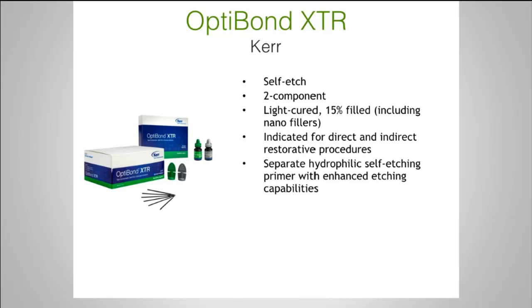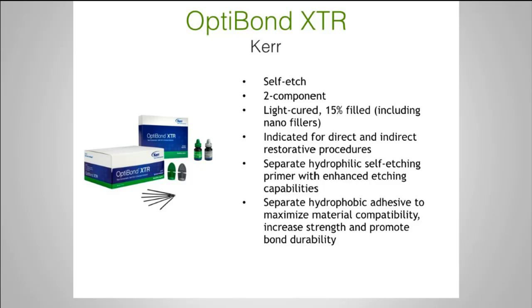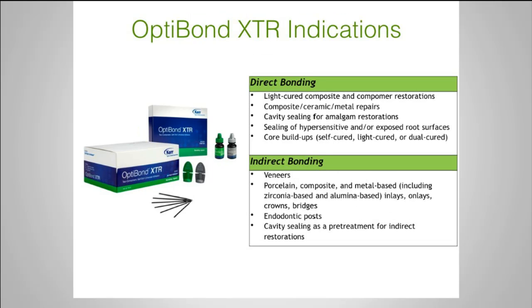When we start talking about the two-bottle component system, I think it's really important, and the reason is that we have the ability to separate the hydrophilic self-etching primer. It allows you to separate the chemistry, so I don't have the hydrophilic and the hydrophobic chemistry all in one bottle. My initial primer coat is the etching step that opens up the tubules and allows infiltration of my hydrophilic monomers. I let that set, air thin it, and come back with a separate hydrophobic bottle, the adhesive bottle, which is really the sealer, the overall closer. It allows the chemistry to stay apart and also keeps an optimal pH, which we'll talk about shortly when we discuss a dual cure situation versus a non-compatible one.